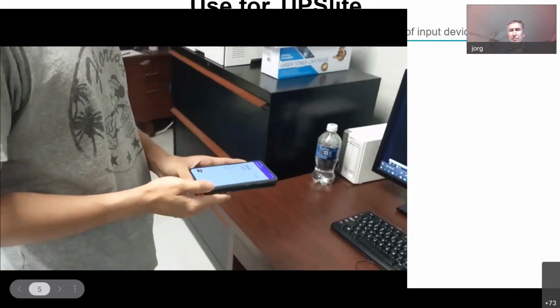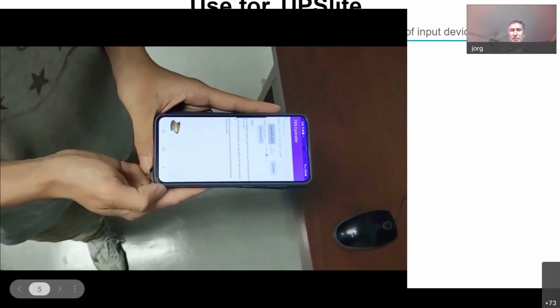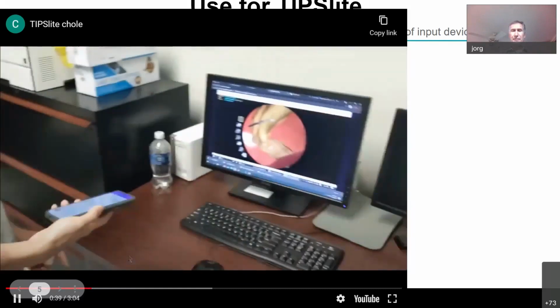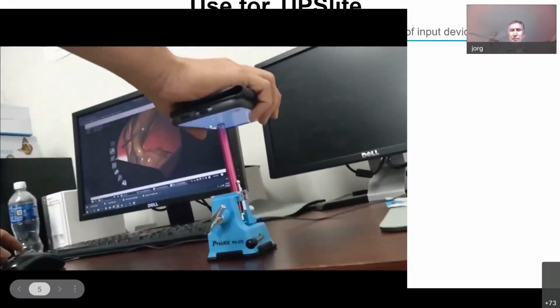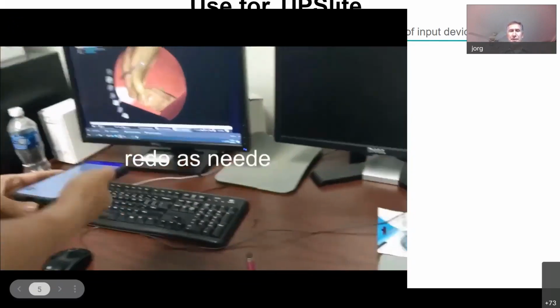So some kind of pairing going on and registration with respect to it. And now you hit the trocar point. So nothing moves unless you touch the pen. And the pen can be held in many different ways.